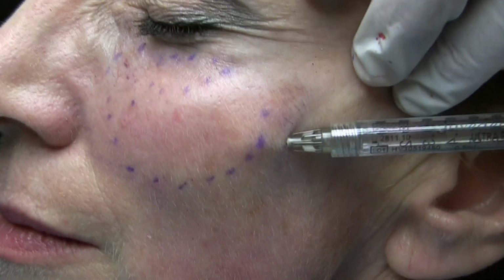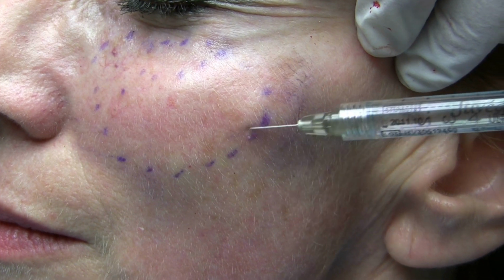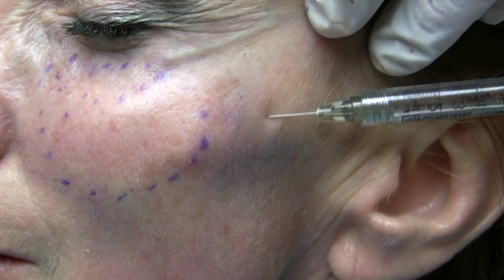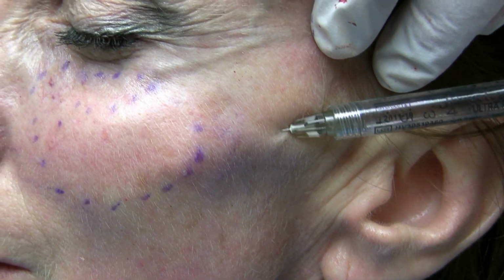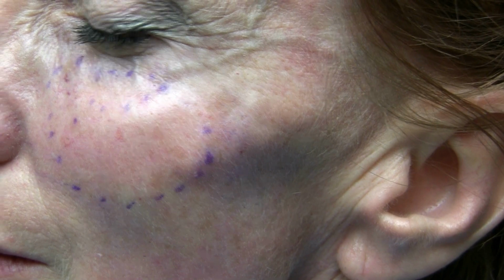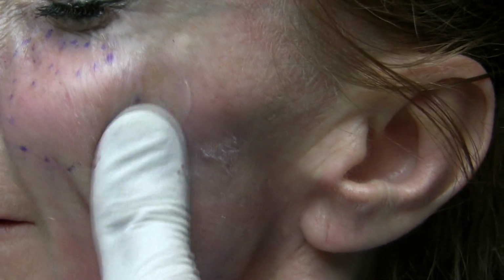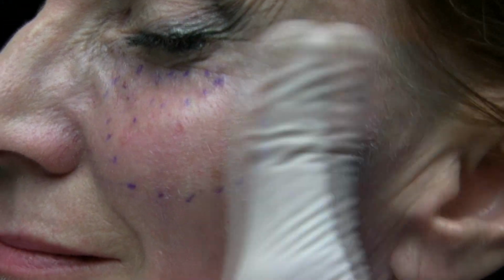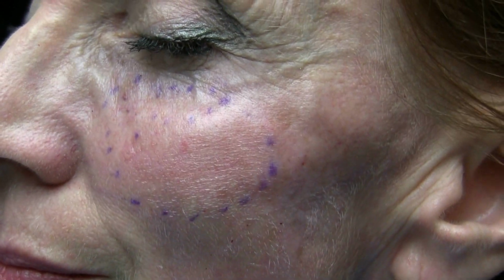So now in finishing the contour of our cheeks, we're going to taper out over the lateral zygoma a little bit, and this is what the patient will notice when she looks in the mirror. She will appreciate that little prominence, because if you don't have this, or if you had it in youth and you don't have it now, when you restore that, it becomes very apparent to the observer.